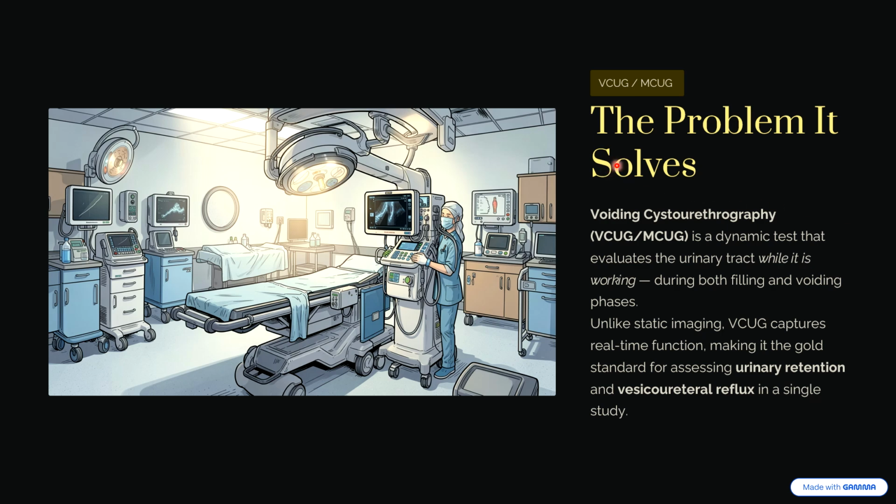So which problem does it actually solve? Voiding cystourethrography, which is also known as VCUG or MCUG, is a dynamic test that evaluates the urinary tract while it is voiding, during both filling and voiding phases. Means not when it is in resting condition, but when it is actually filling and squeezing out the liquid inside, that is the point where it works.